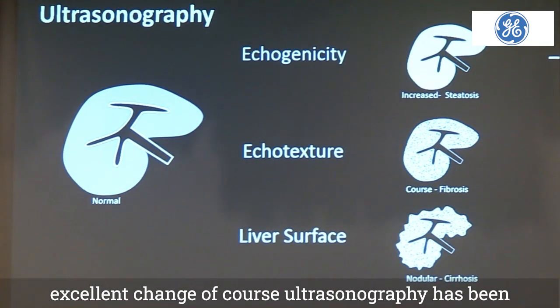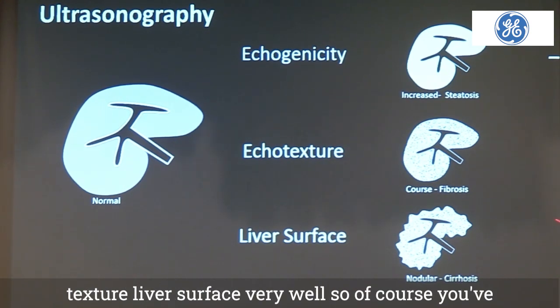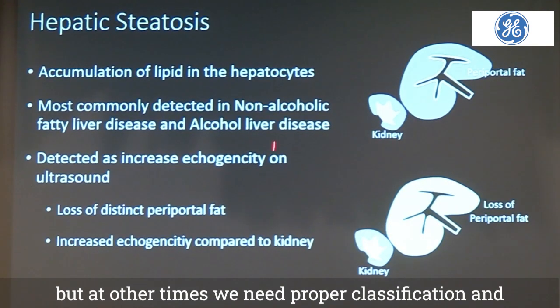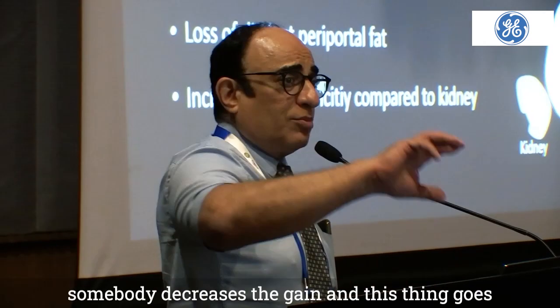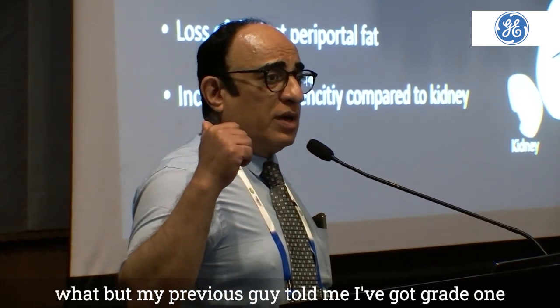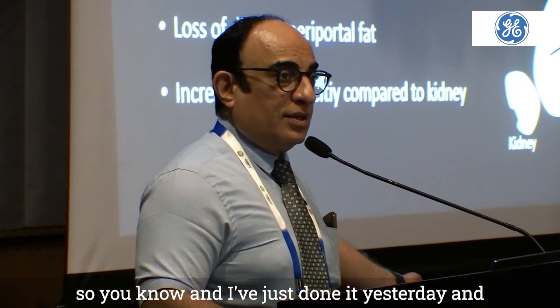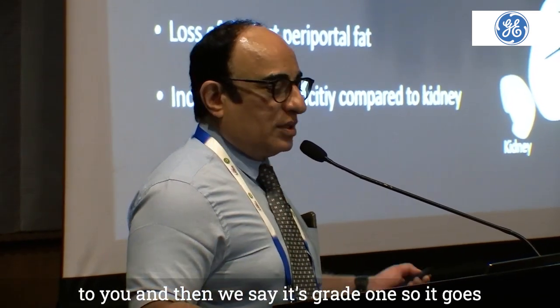Of course, ultrasonography has been good in terms of telling us echogenicity, echo texture, liver surface very well. So of course, you've got a small nodular liver, that is really bad. But at other times, we need proper classification, and we have a lot of inter-observer variation. Somebody increases the gain and calls it fatty liver, somebody decreases the gain, and this thing goes on and on and on. Somebody comes and tells you, oh, but my previous guy told me I've got grade 1 fatty liver, and you're telling me I've got grade 2. So, and I've just done it yesterday. And somebody told me I've got grade 3, so I've come to you, and then we say it's grade 1. So it goes both ways.